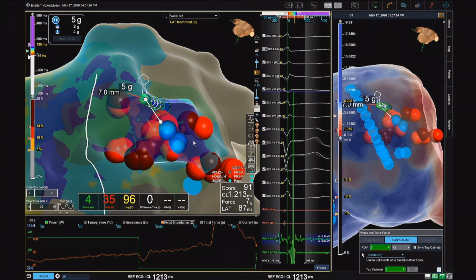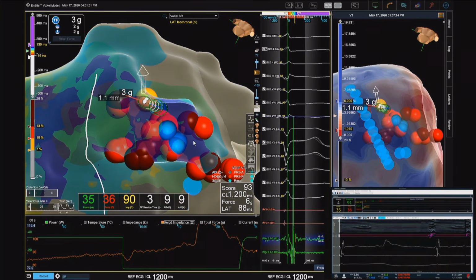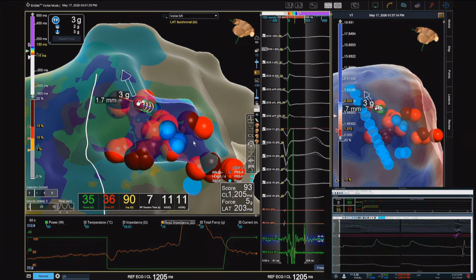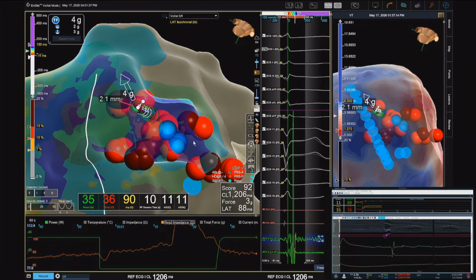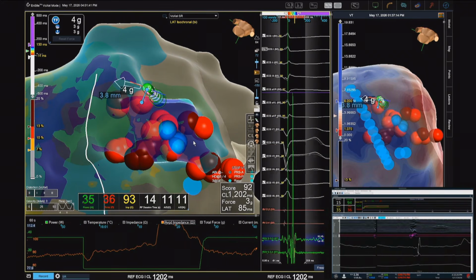60 seconds, usually. I think 30 seconds for a ventricle, it's not a lot with RF in a scar. It is in healthy tissue. It was a late potential here that disappeared again during ablation.